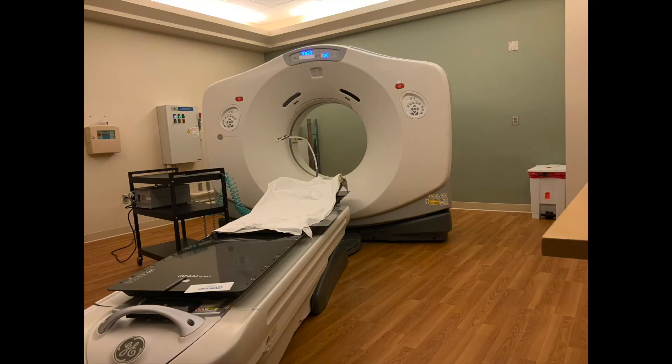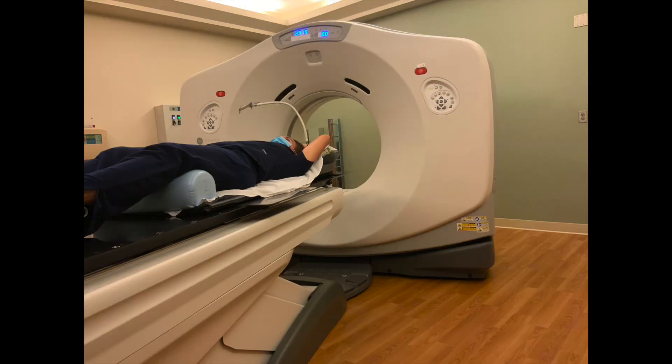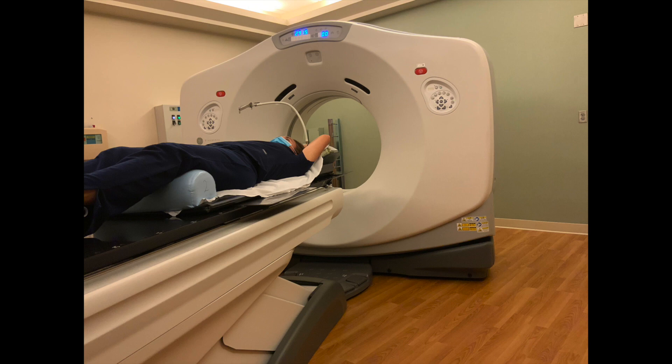This is a CT simulation room. The simulation appointment is not a radiation treatment. During this appointment, we will position you on the table with your arms above your head. Once you are in position, you will go through the CT scanner a few times.